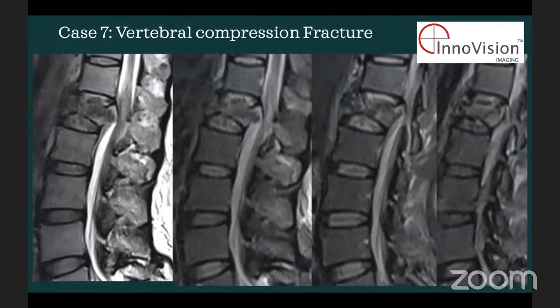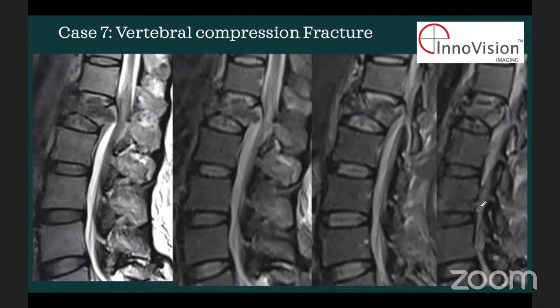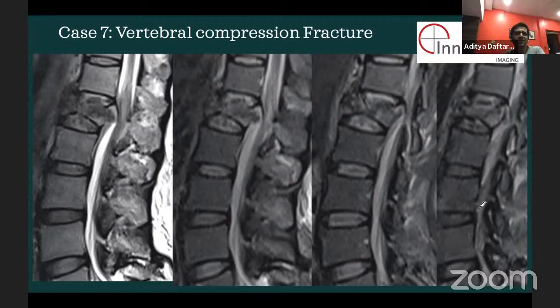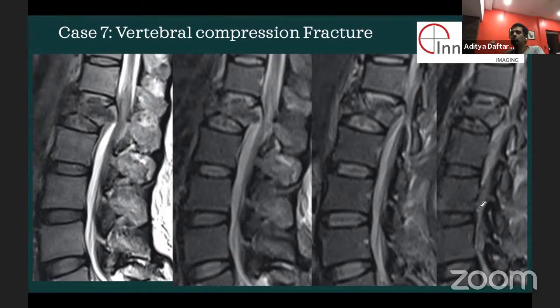So I just wanted to ask for the post-operative scans: when is the contrast to be given and its utilization the best? Immediately, within 3 months, or within 1 month? Depends what your question is, no? If you're suspecting a recurrent disc, whenever you feel the symptoms are there, that's when you will give the contrast. You will always see some post-contrast enhancement even post-op, and then the challenge is just differentiating post-op change from disc. But disc versus scar, the question can be answered at any given point in time with contrast.